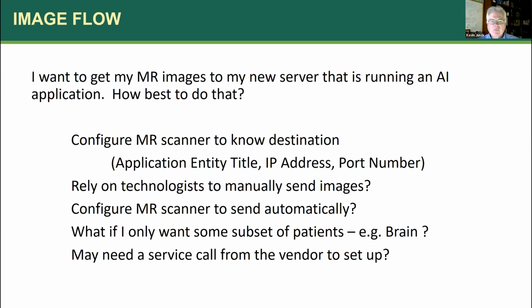And in MR images, I want to get my MR images to my new server. It's running this cool AI application. Well, how do I do that? Well, I can set up the MR scanner to know that destination. In DICOM, there's typically 3 particular items that you need to know to send images to another.